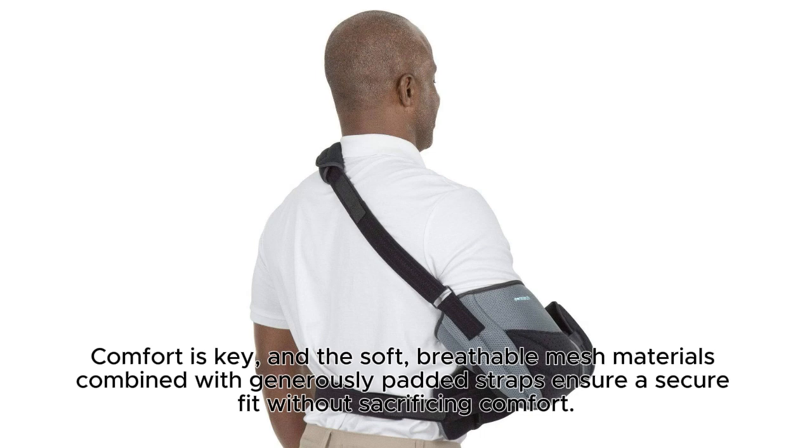Comfort is key, and the soft, breathable mesh materials combined with generously padded straps ensure a secure fit without sacrificing comfort.